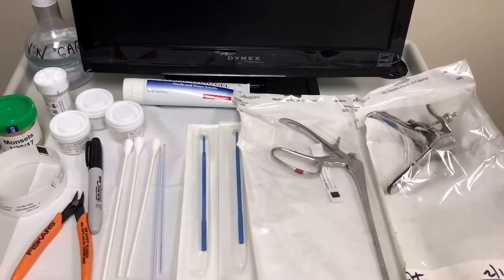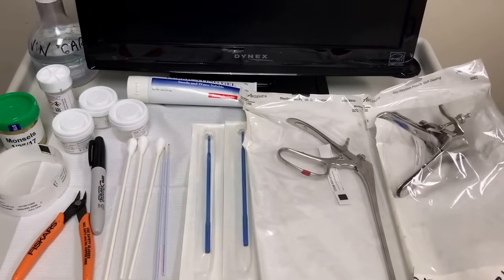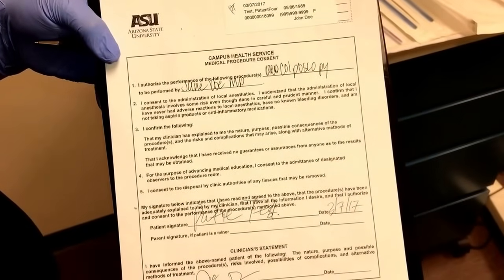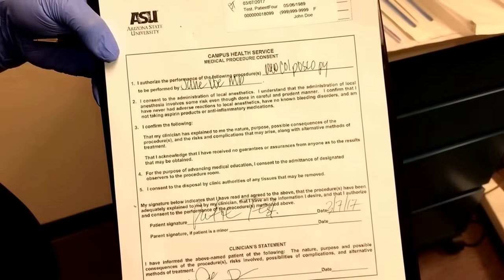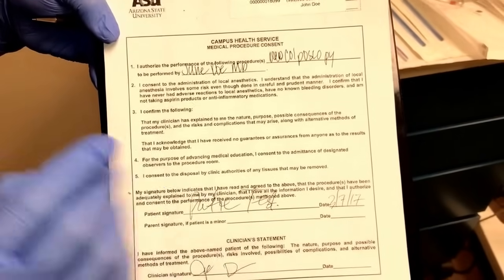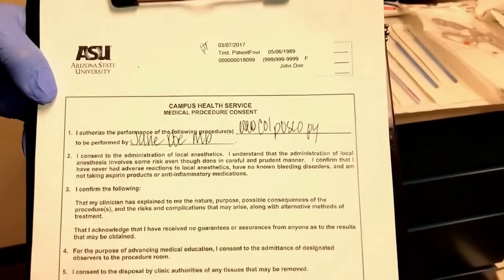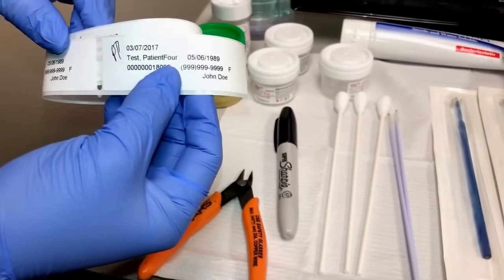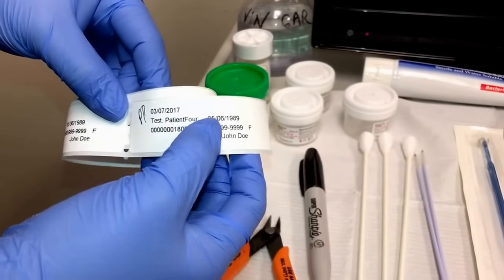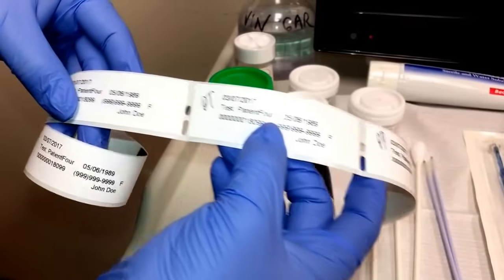Today we will be filming a demonstration of a colposcopy, and the instruments in front of you are the ones we will be using today. Most importantly, before any procedure is started, you want to make sure that you have the medical procedure consent form filled out by the provider, signed by the patient, and with the correct information on the patient label. The label has the patient's initials confirming their first name, last name, and date of birth, and you want to be sure that the patient labels every single one.